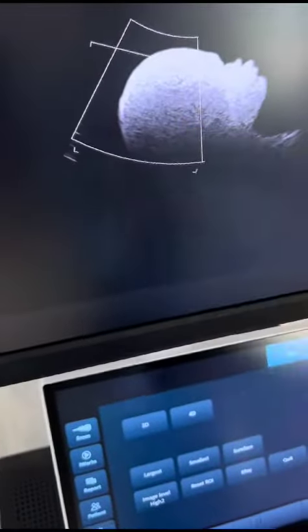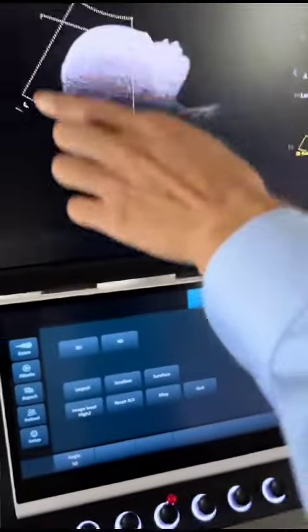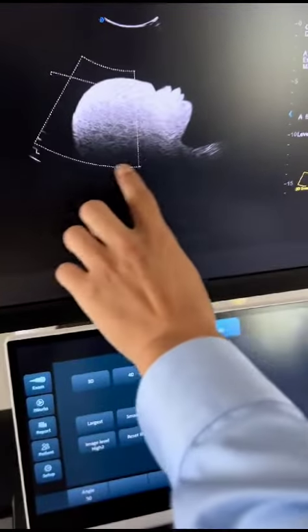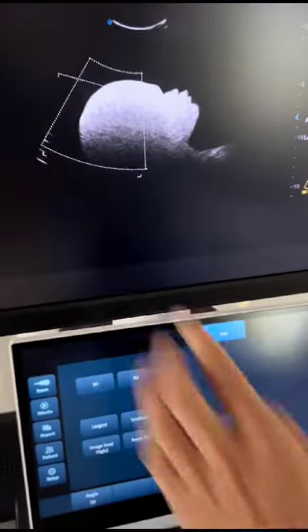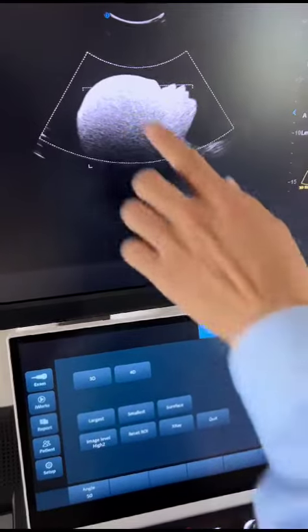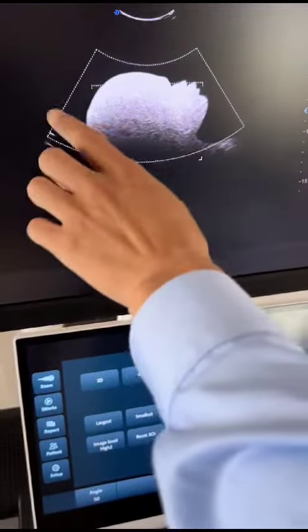Then press this key to adjust the size of the sample area. Just make it include the baby's face.